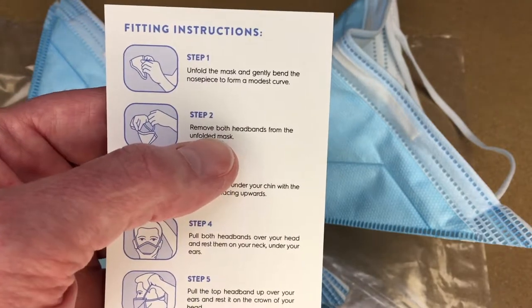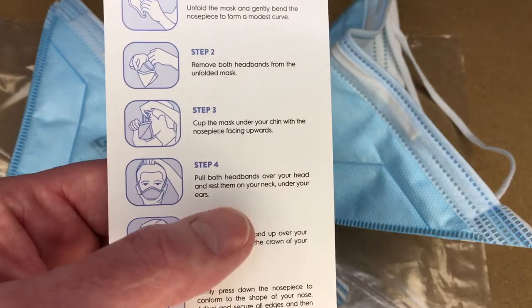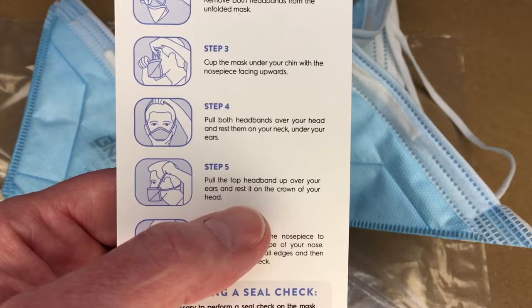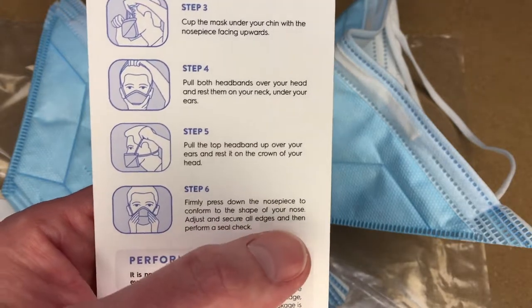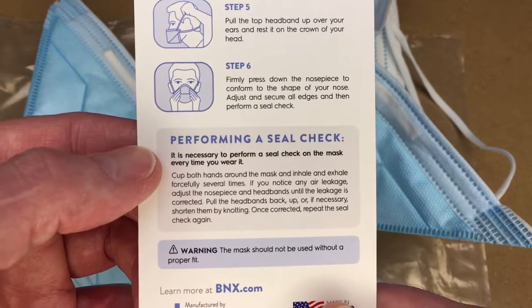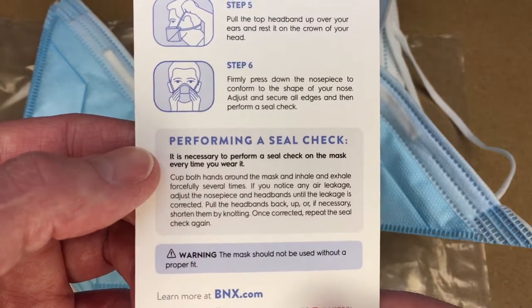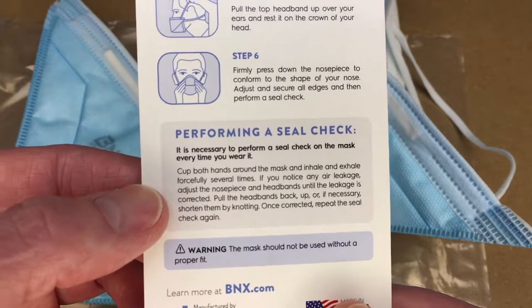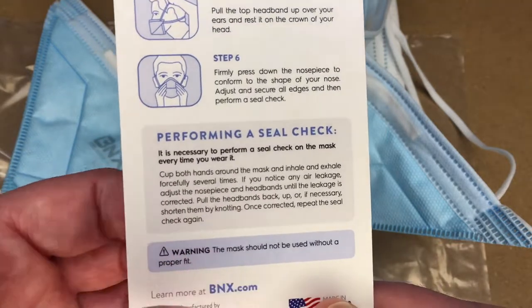The fitting instructions say: unfold the mask and gently bend the nose piece to form a modest curve. Remove both headbands from the unfolded mask and cup it under your chin with the nose piece facing forward. Pull both headbands over your head and rest them on your neck under your ears, then pull the top headband over your ears and rest it on the crown of your head. Firmly press down on the nose piece and perform a seal check by cupping both hands around the mask and inhaling and exhaling forcefully. Adjust if there's any air leakage.